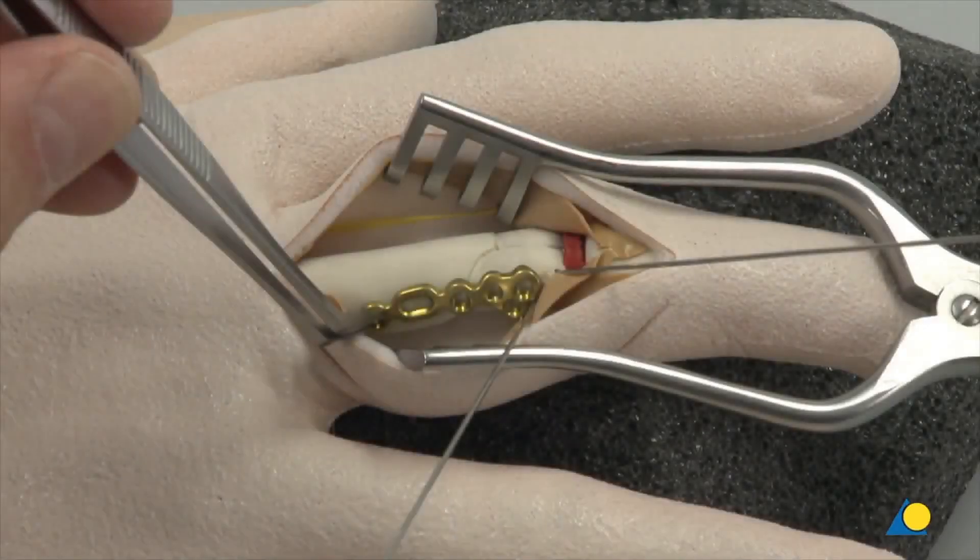The plate comes in both right- and left-handed versions. The correct plate is chosen based on whether the plate will be applied on the ulnar or radial side of the proximal phalanx. The volar extension of the plate must be volar in order not to interfere with the collateral ligament insertion.